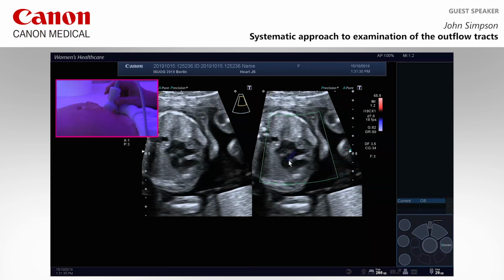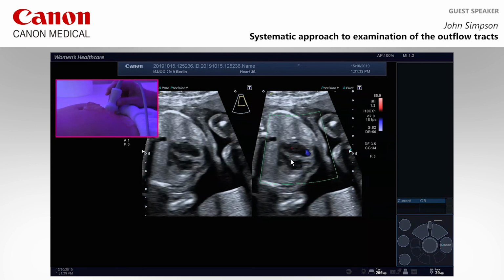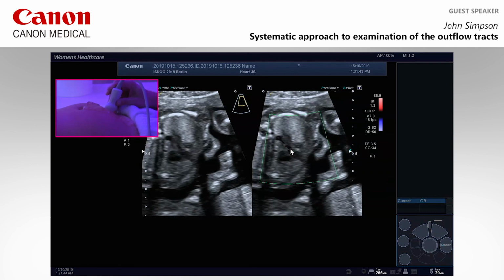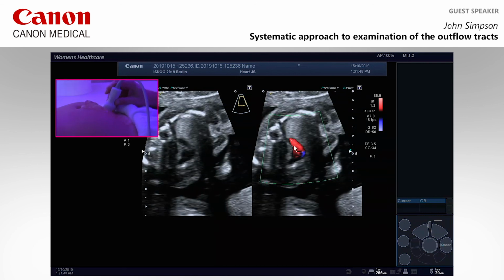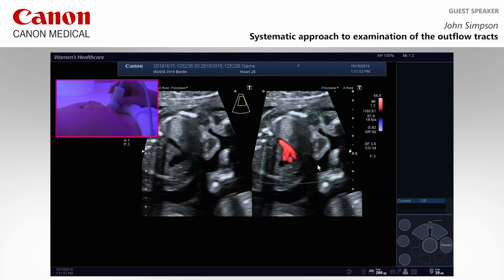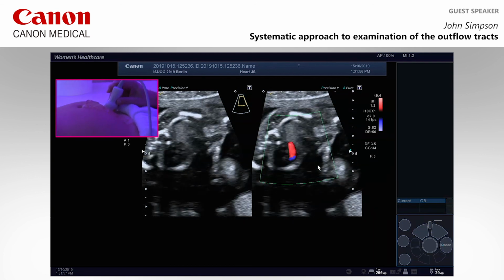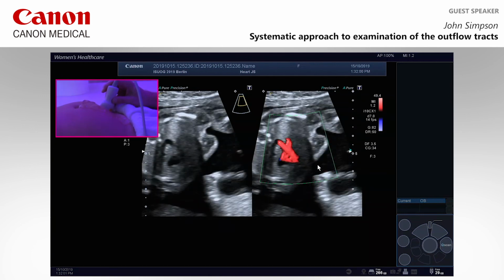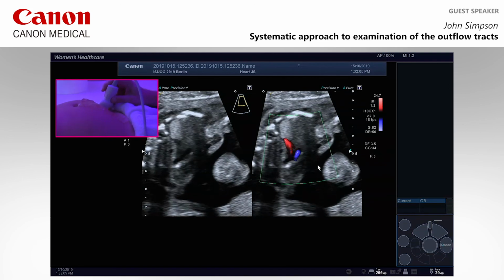Back down towards LVOT, so it's very much pattern recognition. 4 chambers, first vessel LVOT to the right shoulder, second vessel RVOT, which branches, third vessel forming the V in the upper part of the chest. If you're looking at things like aberrant vessels, then clearly you can continue your sweep into the upper mediastinum to identify the branching patterns, aberrant subclavians, etc., etc.